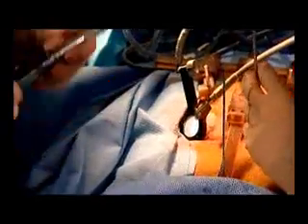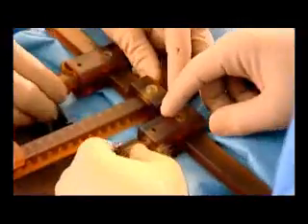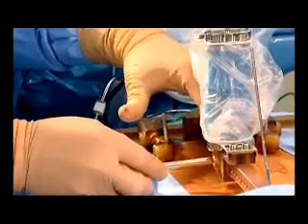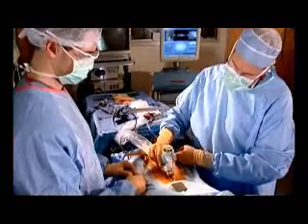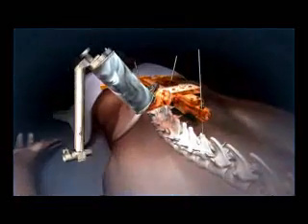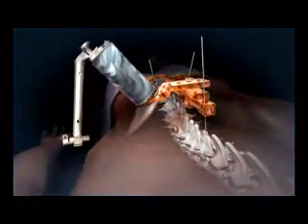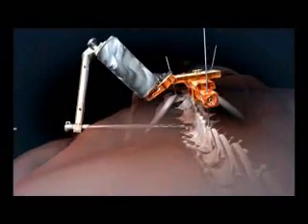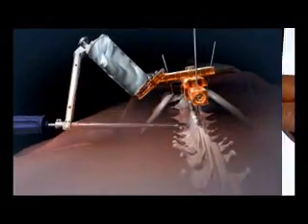With a single placement of the T-frame, the surgeon can perform a variety of procedures on multiple vertebrae while moving along the length of the spine. While utilizing a percutaneous less invasive technique using an extension bridge, the miniature robotic device is used to reach a variety of surgical approaches.